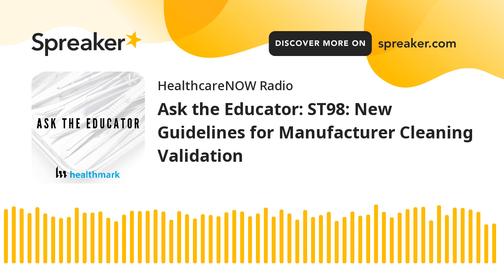Let me tell you, and I know I'm talking to people who are out in the field all the time, I can remember going into a facility and looking at a washer disinfector. We were not even there for that purpose. I was there with your colleague, Steve Kovac, doing an in-service on something else. And we're looking at this washer, and there's water shooting out where the spin arm is supposed to be. The spin arm was supposed to be there. Is that worst case? For a device manufacturer, that might be real world, but you're not expected to address misuse. That would be an example of misuse, right?